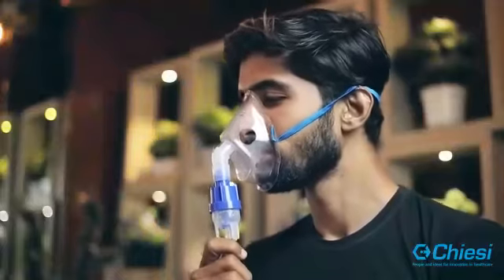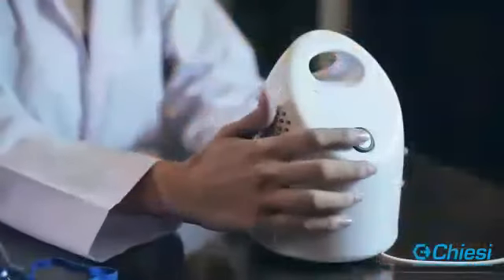Hold the medicine chamber in an upright position. It will prevent spilling and promotes better nebulization. Continue this process for 10 to 15 minutes. The change in the sound of the nebulizer is an indicator that the medicine is finished. Now turn off the nebulizer.